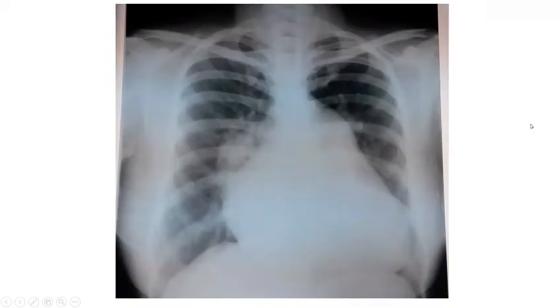Diagnosis? ASD Eisenmenger? Yes, Eisenmenger. You cannot use the word Eisenmenger. Why did you say Eisenmenger? Sorry, sir. First of all, you should say why you said ASD. ASD because, sir, there is a cardiomegaly present, prominent right descending pulmonary arteries, sir, RA also enlarged. Okay. Sir, the apex is of RV type.